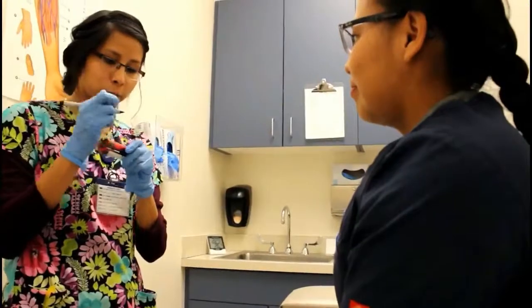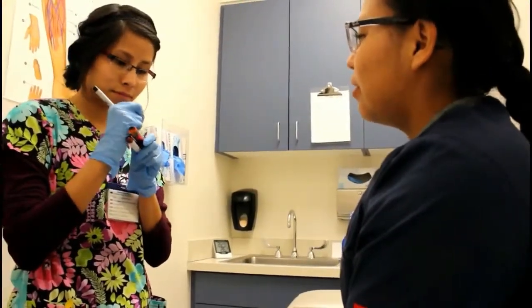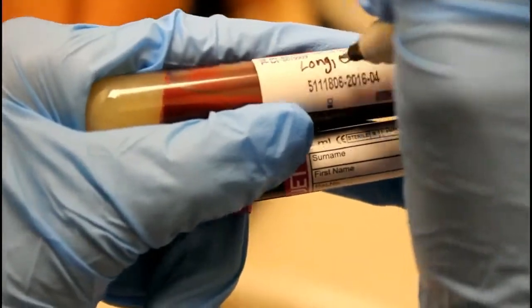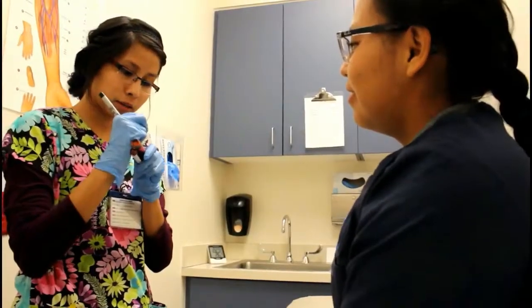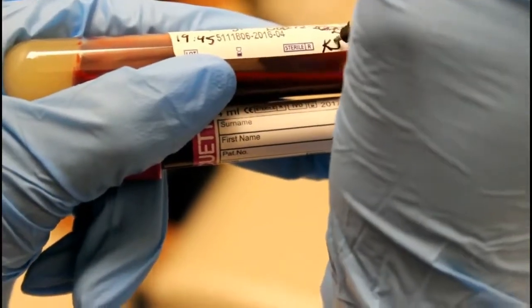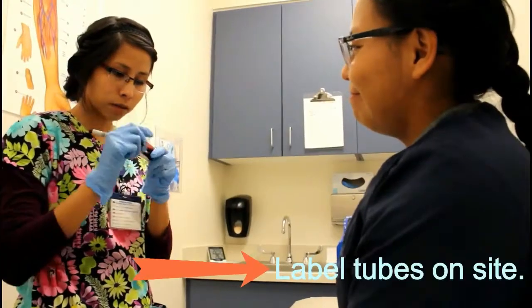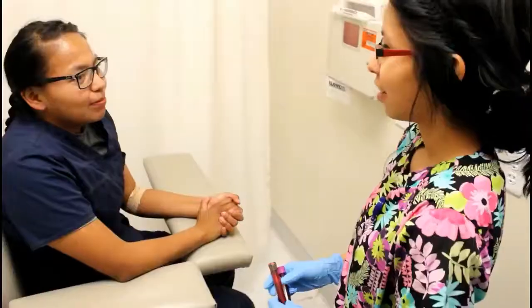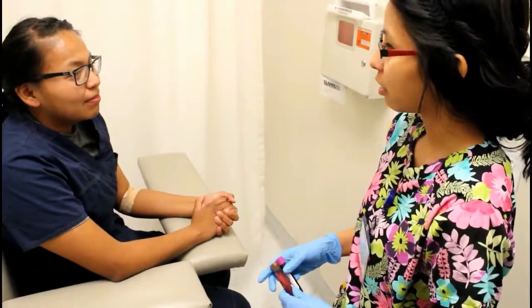Make sure you label all the tubes. Again, ask the patient to spell their last and first name and date of birth on site. Other information includes today's date, time of draw, and initials of phlebotomist. Thank the patient and see if they have any questions or need anything.